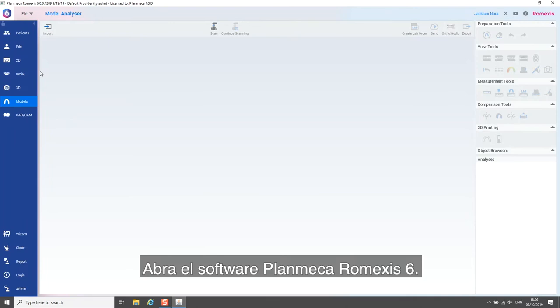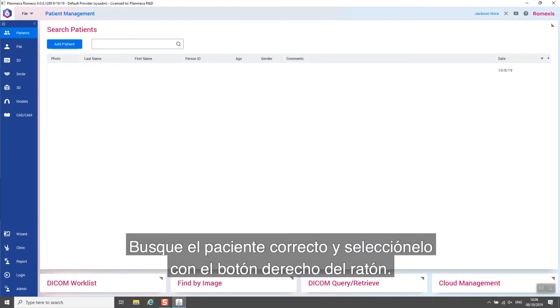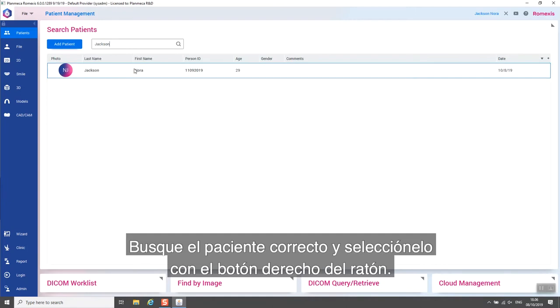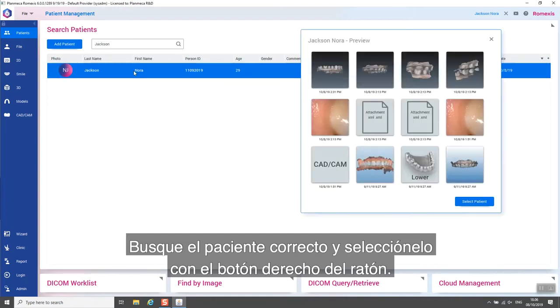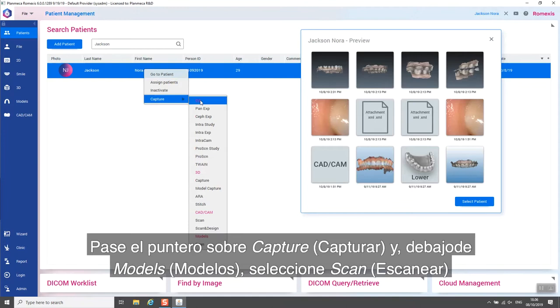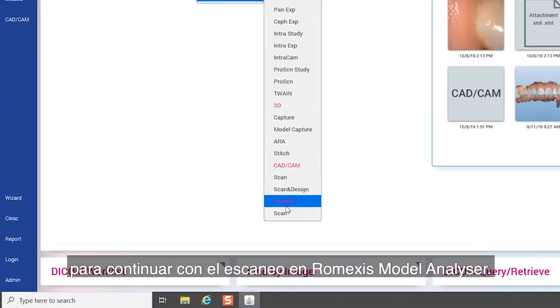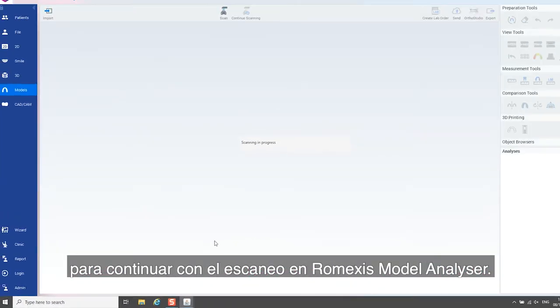Open the PlanMeka Romexis 6 software. Search and select the right patient using the right button of the mouse. Hover your mouse over Capture and under Models select Scan to proceed to scanning in Romexis Model Analyzer.